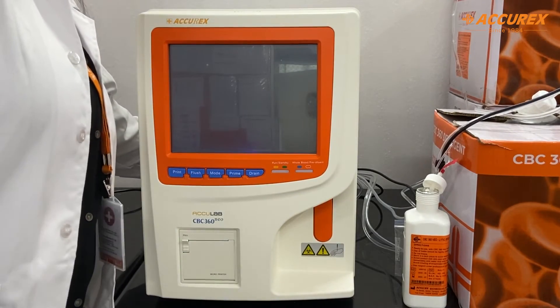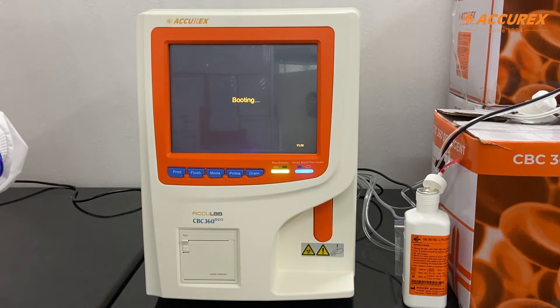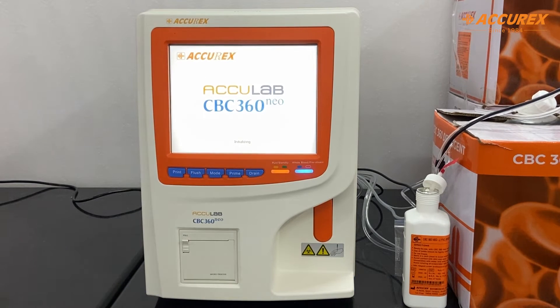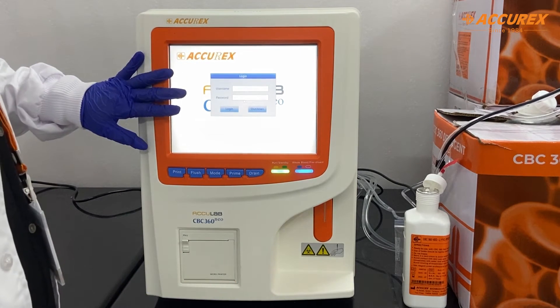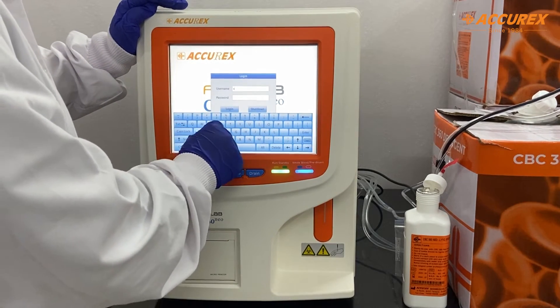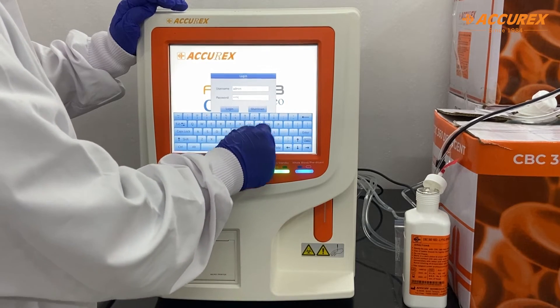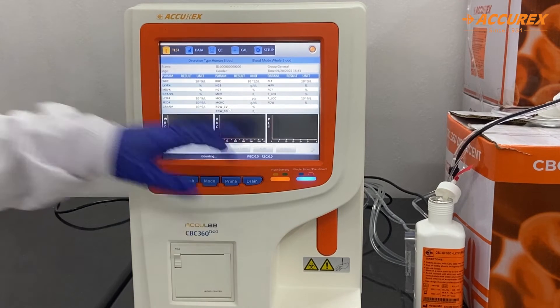Now we will start the analyzer. Before starting, make sure all the tubes are in the reagent. This is the start screen of the analyzer. Now the analyzer has started — it is initializing. Now enter the user ID and the password, which is admin/admin. Once this orange light turns green, you will know that the machine is ready to use.